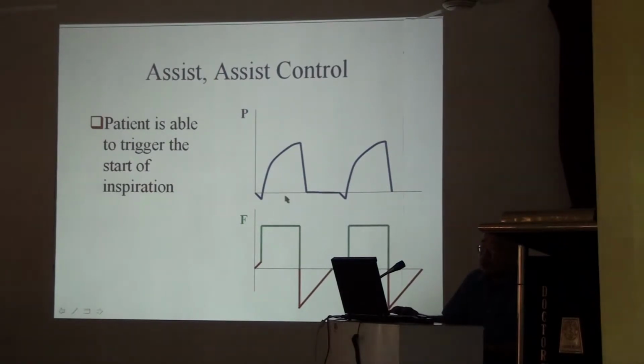Now look at this respiration. This is the same as the previous one. But what is the difference? There is a notch here. See, there is a notch. That means the patient has started taking inspiration. So pressure has gone negative.